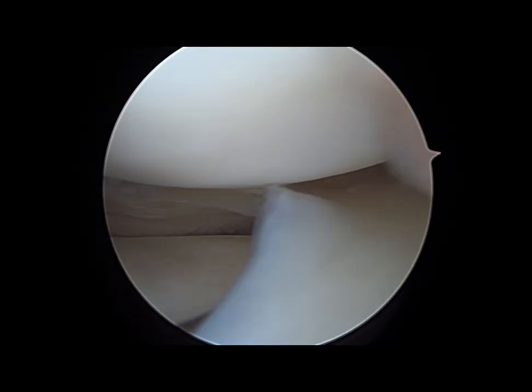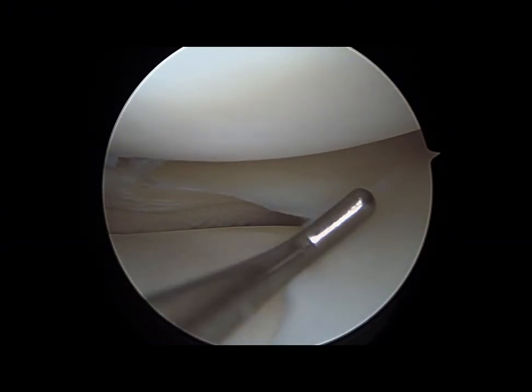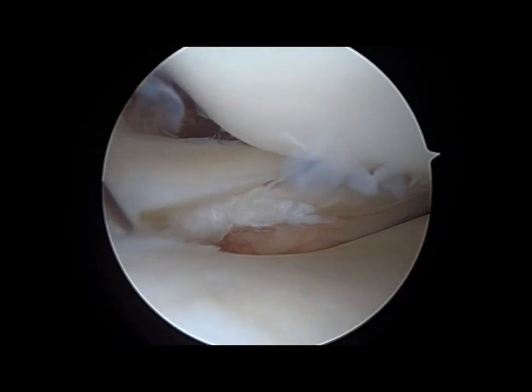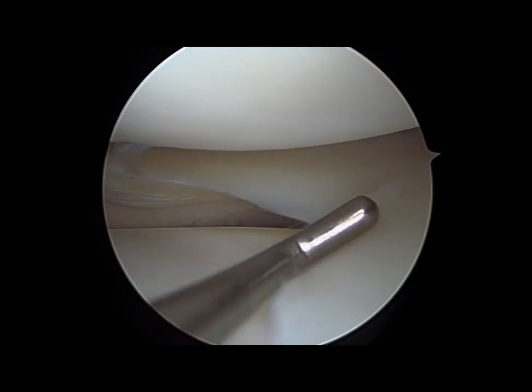With the knee in a figure of 4 position and the arthroscope placed via an anterolateral portal, we identify the radial tear in the body of the lateral meniscus. The insertion of the probe showcases such a lesion. This should be an alerting sign to go probe the posterior root of the lateral meniscus so as not to miss a lesion of the meniscotibial attachment.